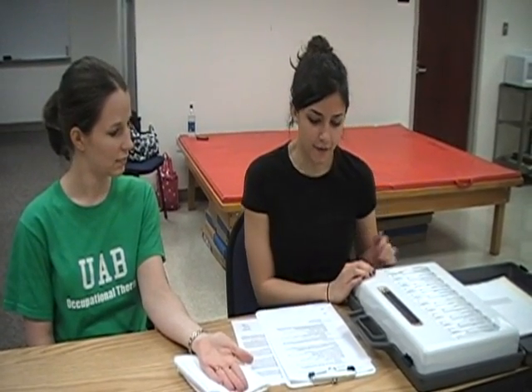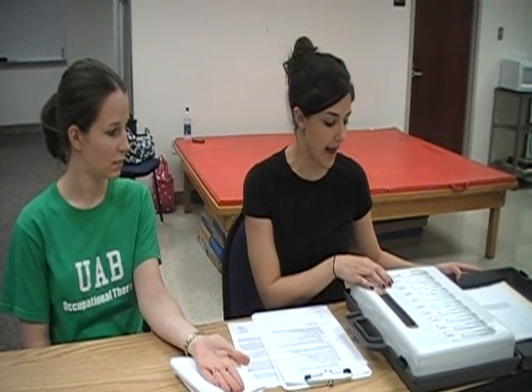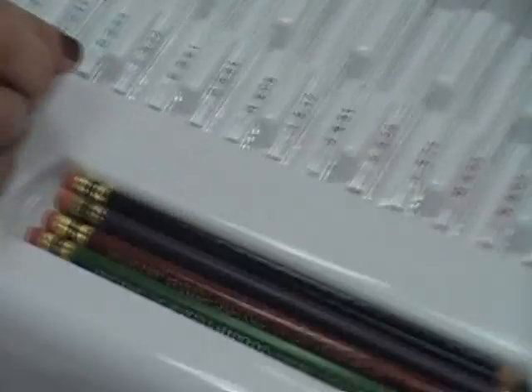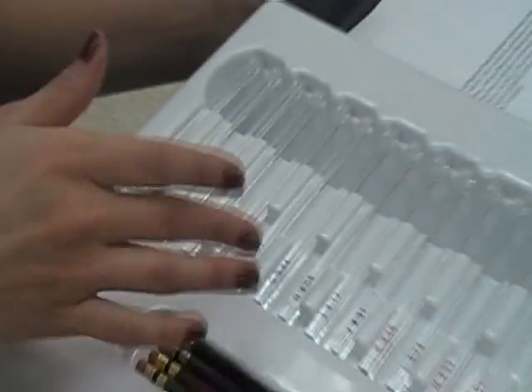You want to start off with the highest number in the normal category — the highest number in the green, which is 2.83. So you start with that, and if they can feel it, you would move to a lower category. If they can't feel it, you would move up to the blue, which is a higher category.